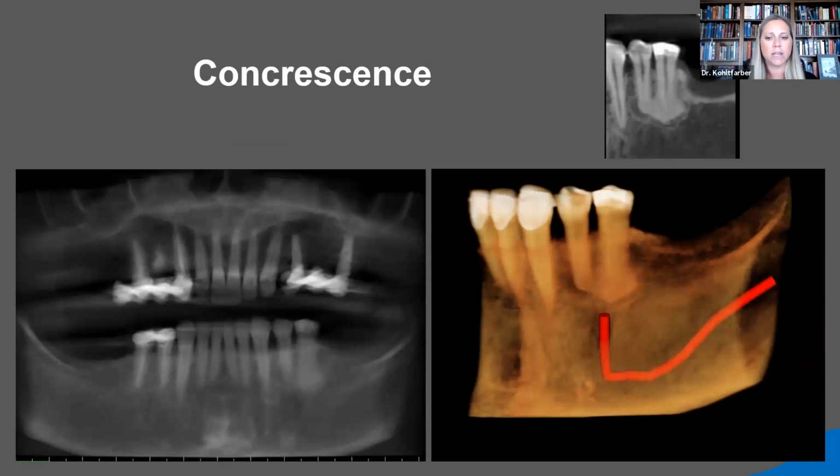And here's some fun cases that kind of demonstrate it. Here we have concrescence, or fusion, of 2 teeth. They're fused by the cementum. And we've had several cases.